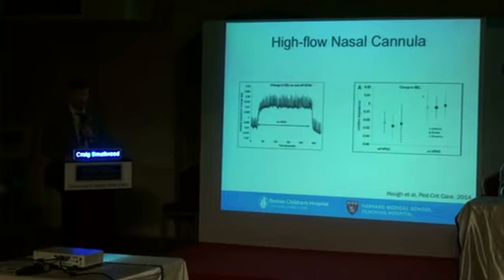So high-flow nasal cannula. I think high-flow nasal cannula is another really hot area of research, and I think it was a marriage of convenience more than anything else. But there's been a lot of researchers who are interested in trying to identify why high-flow nasal cannula works. There's lots of data in neonates and pediatrics and even adults that applying a high-flow nasal cannula can really reduce the need for a lot of other forms of non-invasive or even invasive ventilation. But it's still a little bit perplexing as to what actually is happening during high-flow nasal cannula that has led to the physiologic resolution of symptoms and subsequent avoidance of intubation.